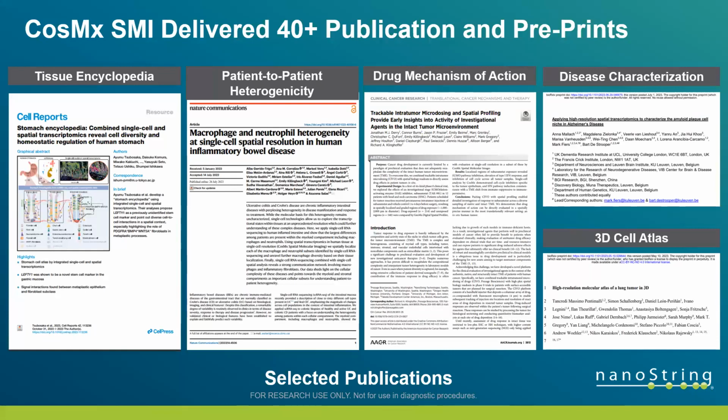All right, Seth, we had a question of whether the 64-plex protein assay can be overlaid on top of the 1,000-plex assay. Yeah, the way that we're envisioning running the assay today is on a serial section. So the way we would look today is to do a serial section of the RNA and the protein.